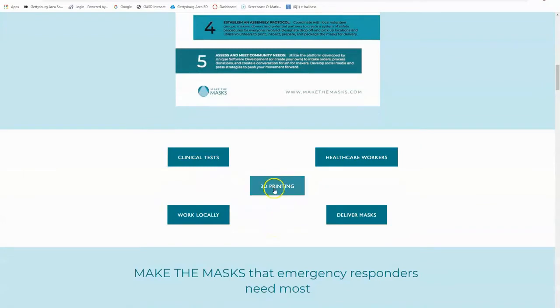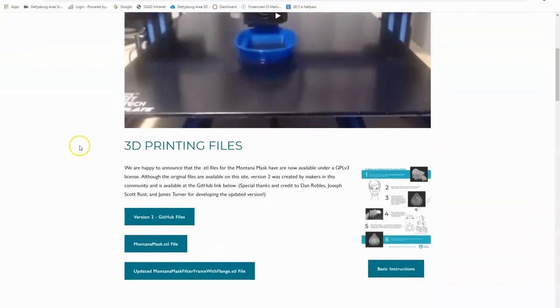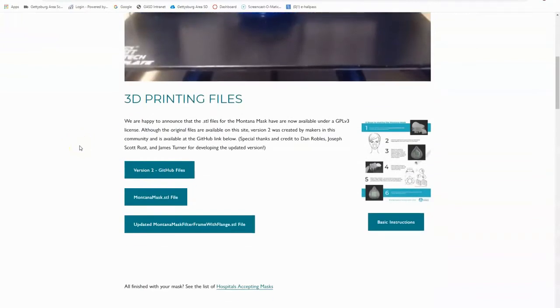So what we're going to do is go ahead to the 3D printing tab here, and I'll click on that tab. What that's going to do is open up all the information on printing this particular object. So here we can find our 3D printed files.